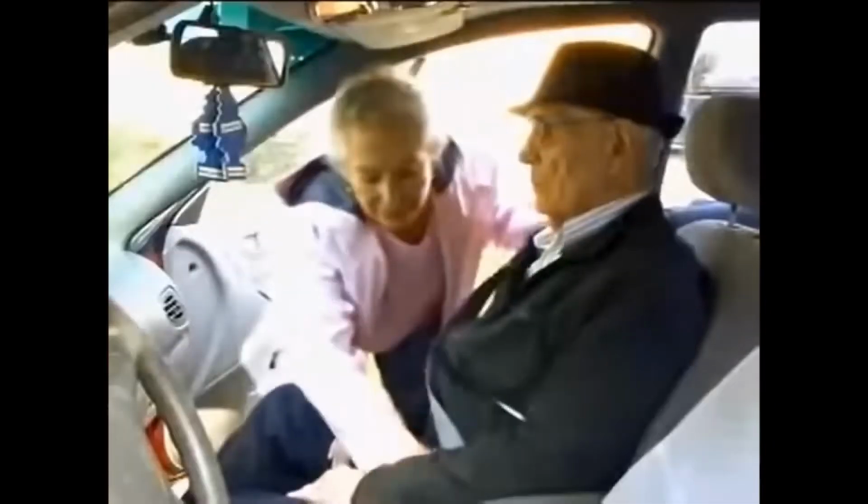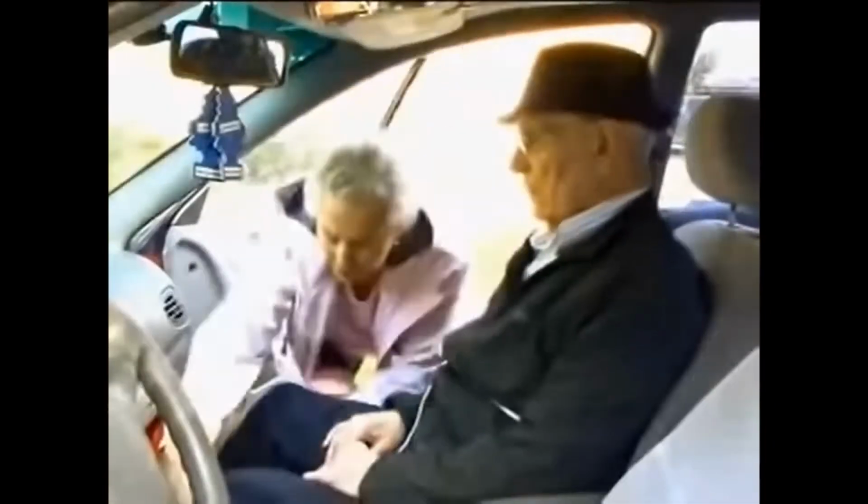Lock the brakes to prevent the wheelchair from moving, and swing the leg rests out of the way to give you more room to work. Next, unsnap the seatbelt. Assist your loved one to turn their body, lift their legs out of the car, and scoot to the edge of the seat. Get a good grip on the gait belt and help the person to stand.